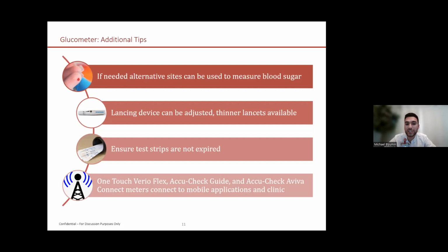Always want to ensure your test strips are not expired. An expired test strip, we can't really say that reading is accurate. And we don't often think about things like test strips expiring. So always check the expiration date on your bottle.